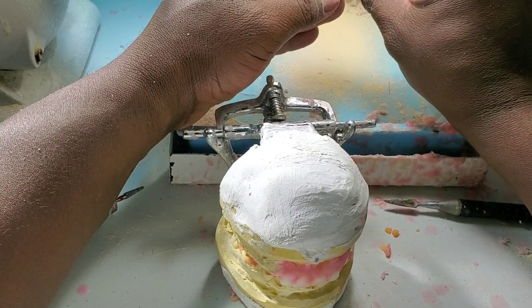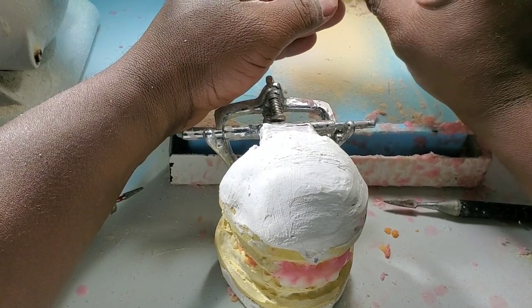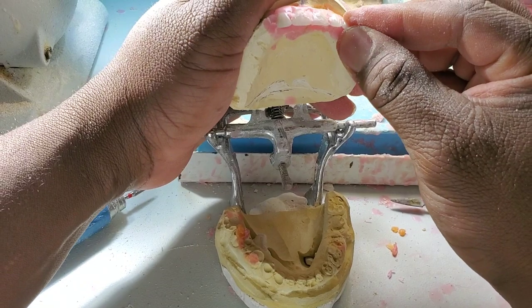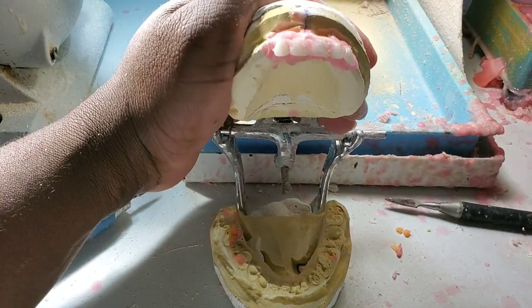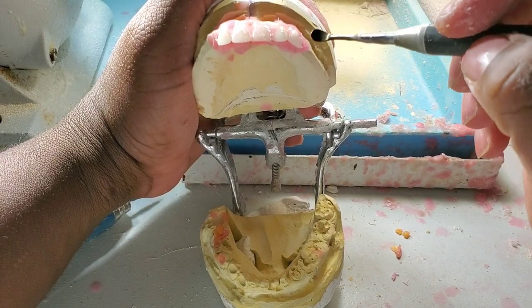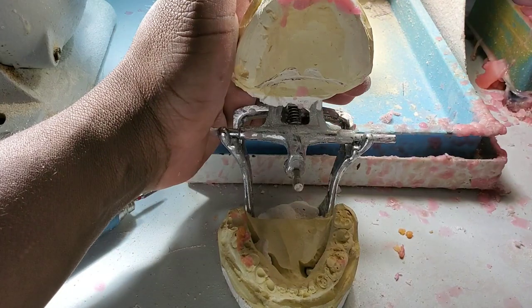I'm going to put my canines on. Right on the bone — I'm putting my canine right on the bone. That's how you do immediate dentures. The person still has their teeth on, but you go by the arch.